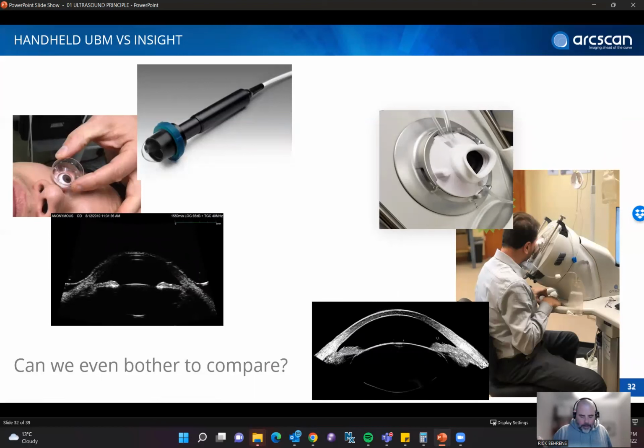Yes, they both use an interface to fill an area with fluid. They both use a probe, and they're both analyzing the eyes. Well, in the same way that a Tesla is like an Opel Manta. You cannot compare the coolness of the Opel Manta, but it's not the same car. It is totally two different things.